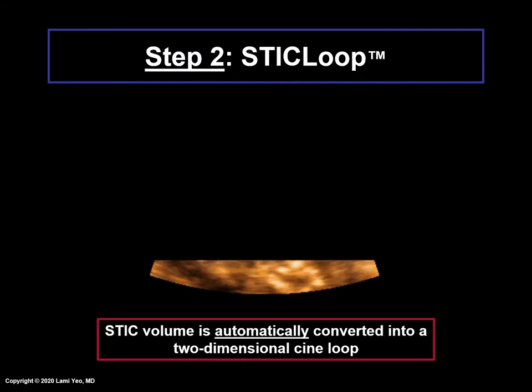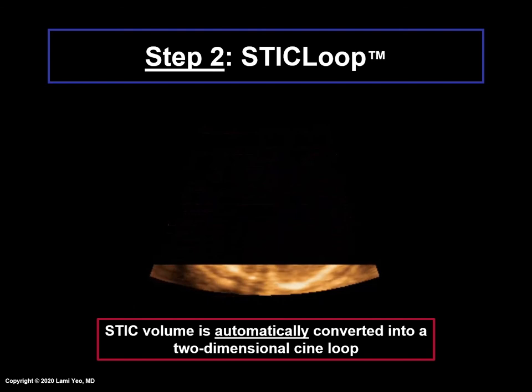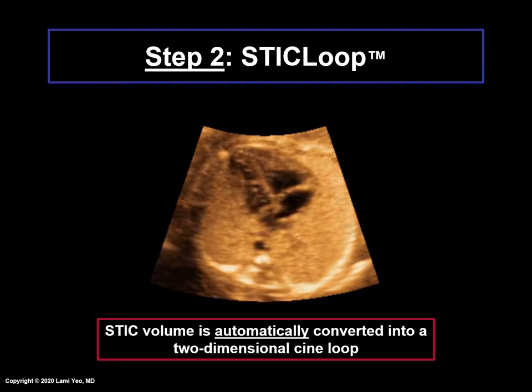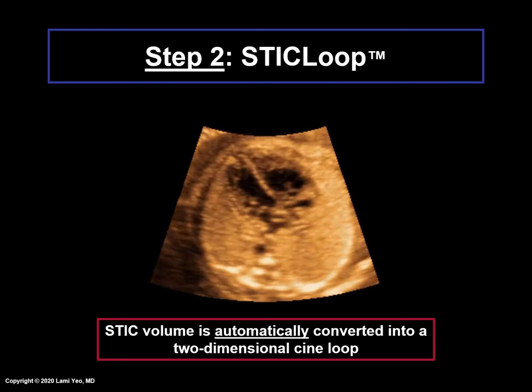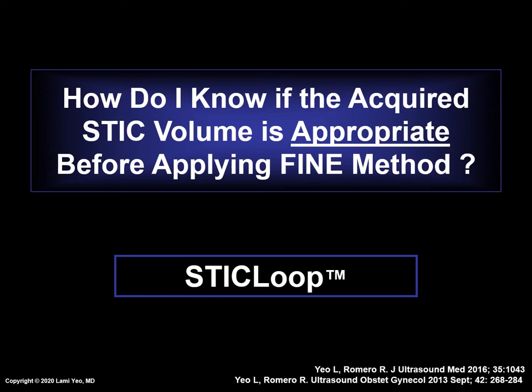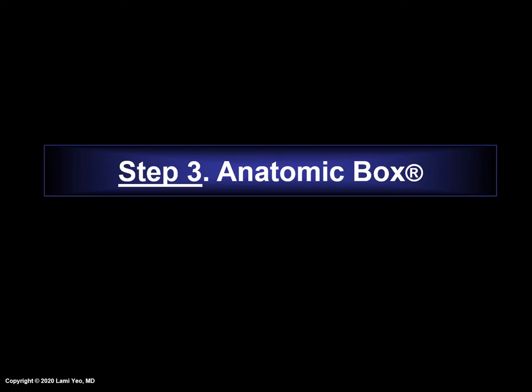The second step is STIC loop. Once a STIC volume has been acquired, FINE automatically converts the volume into a two-dimensional cine loop that scrolls in a continuous fashion — this is why it is known as STIC loop. This tool aids the user in determining the appropriateness of STIC volumes before applying the FINE method. Using STIC loop, the operator observes whether or not certain criteria are met.